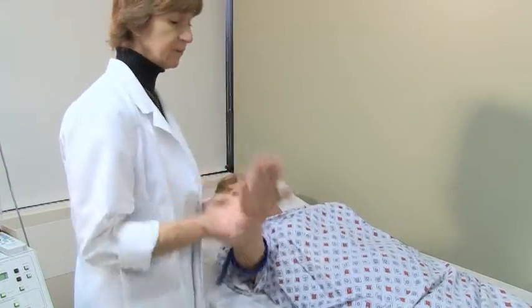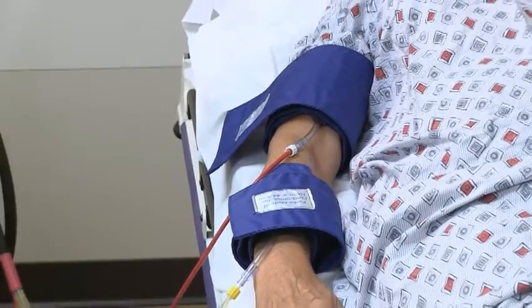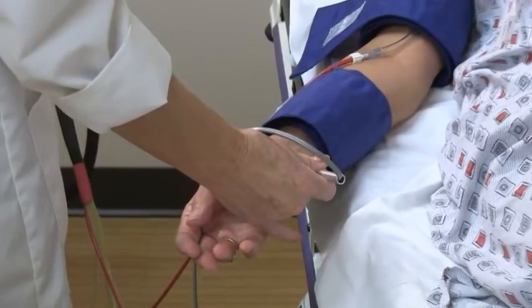Two measurements will be taken with the blood pressure cuffs. The first measurement, the cuffs will pump up slightly. The second measurement is a blood pressure and will be slightly tighter. This is just the same as taking the blood pressure in your arm.